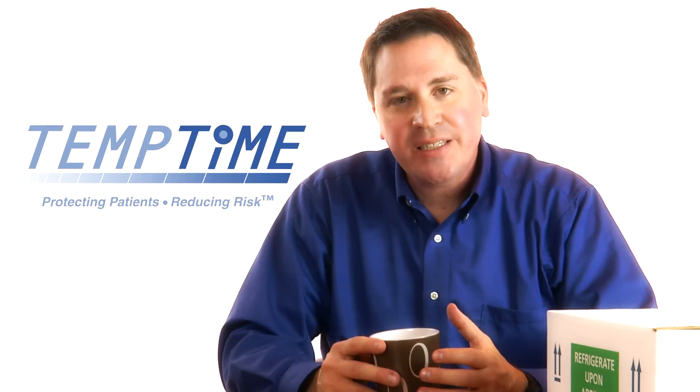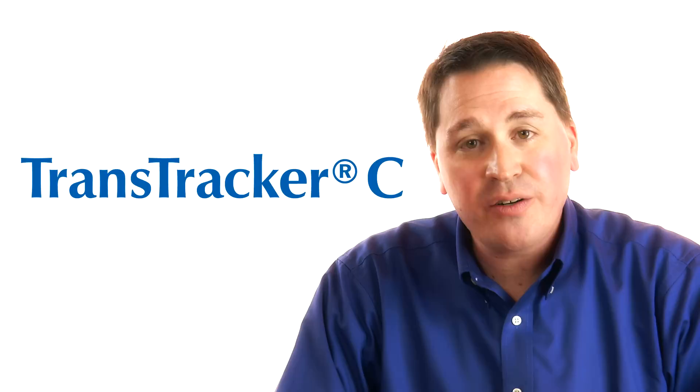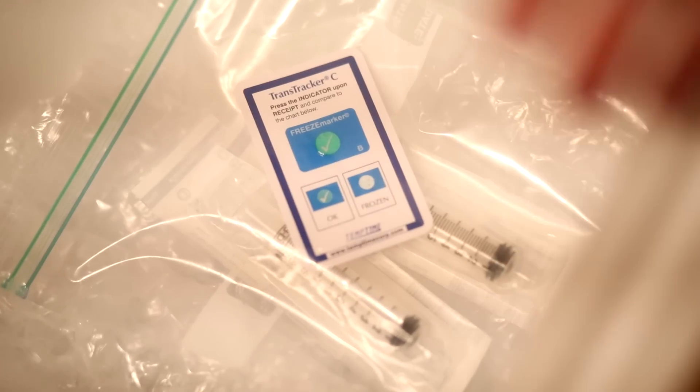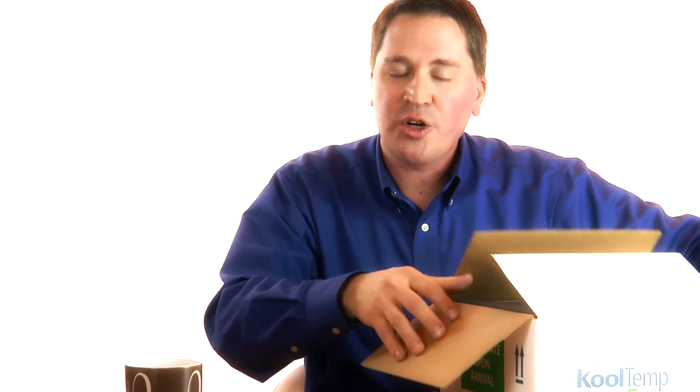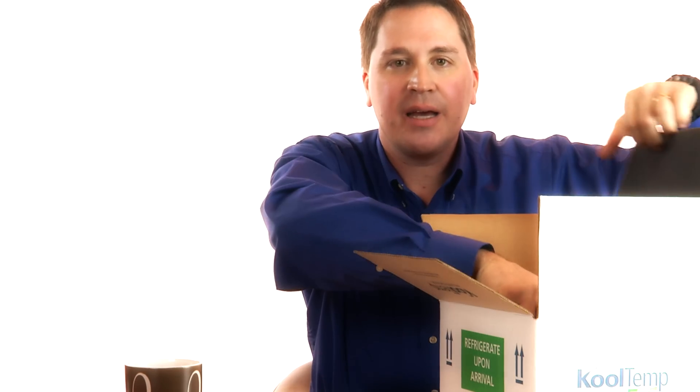You've just received a package from your pharmacy, and inside you found a TransTracker C. The product you received is temperature sensitive, and your pharmacy has taken a number of steps to maintain that medication at the appropriate temperature, such as the thermal packaging your product arrived in and the TransTracker C they provided with your shipment.